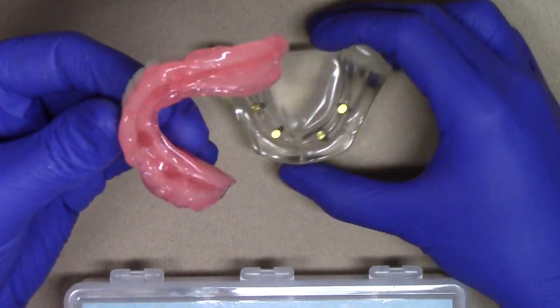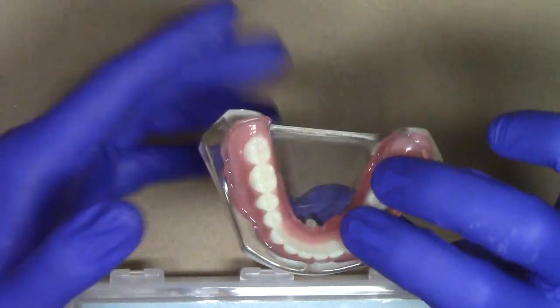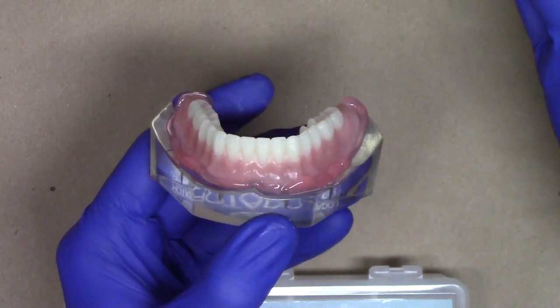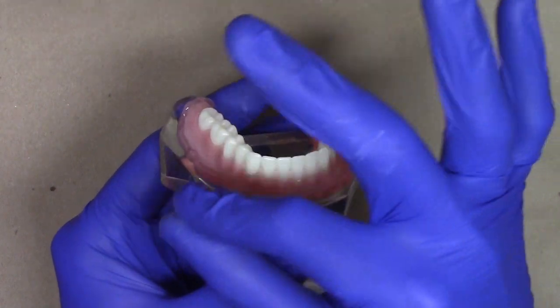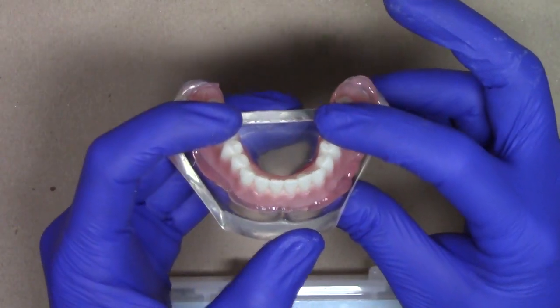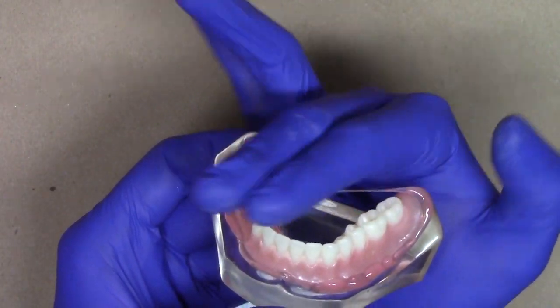I'm going to take this and very gently seat it onto my patient, ensuring that I've got even pressure all the way around. Now at this stage, I'd have the patient close down into the MICP or into the centric position, and I would also do some very gentle border molding, rubbing the cheeks from the side, and the lip, just gently tugging the lip. And then after the patient closes down, have the patient very gently swallow, stick out their tongue, move it side to side, so kind of like this, and then this.